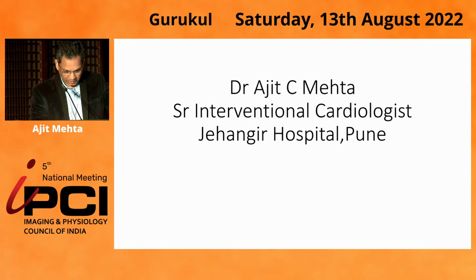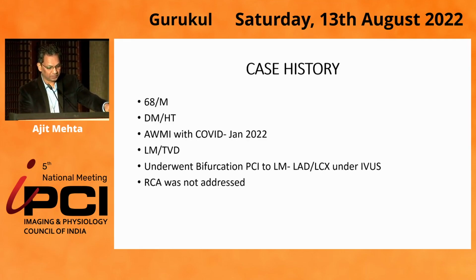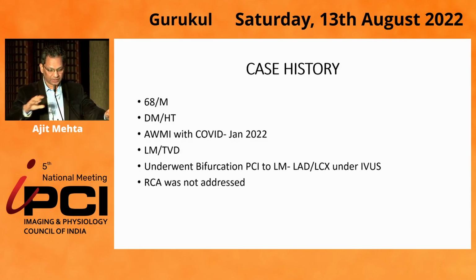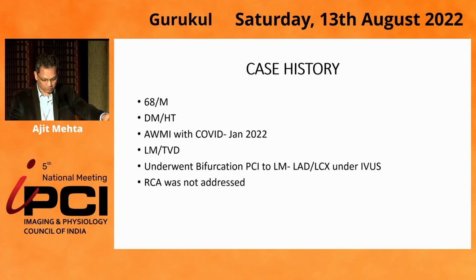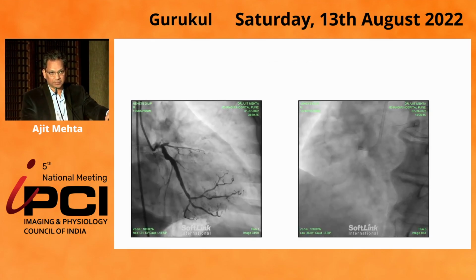My case is a 68-year-old gentleman, a known case of diabetes and hypertension, who presented to us with anterior MI in January this year with COVID. We took him for primary angioplasty, and this was the angiogram.